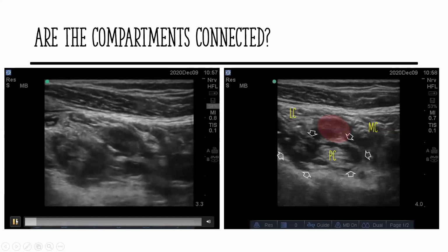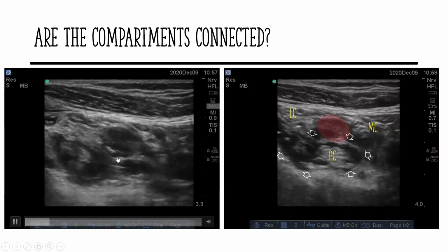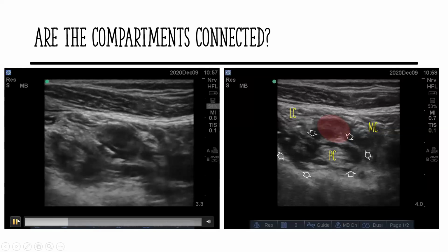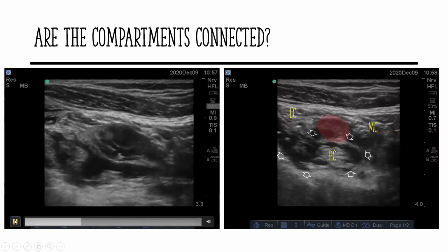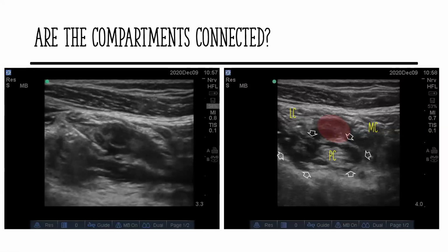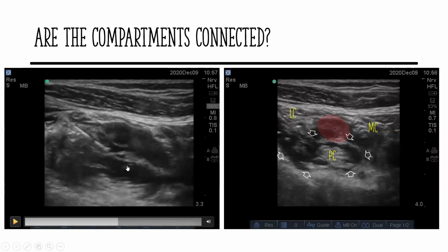I'm just demonstrating again. So this particular sheath is being penetrated. As you penetrate that sheath, you get access more towards the posterior cord, just beyond that, and then inject your local. So now the needle has penetrated this. This is the posterior surface of the artery where we are targeting. You can see that this is separating the cord from the posterior aspect of the artery, multiple sleeves, and then you inject your local anesthetic here.